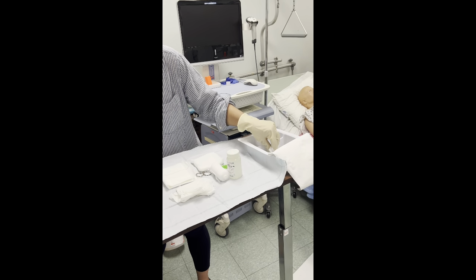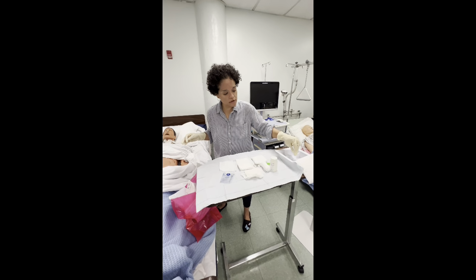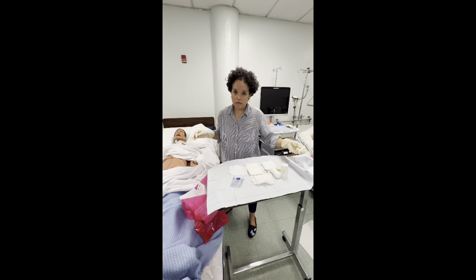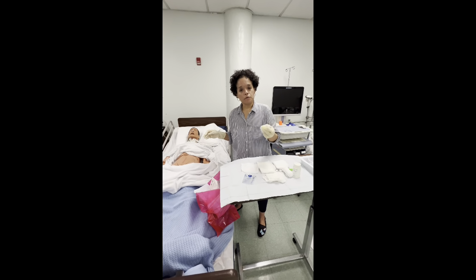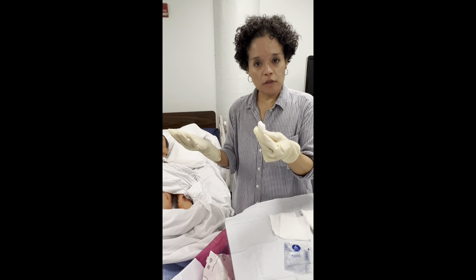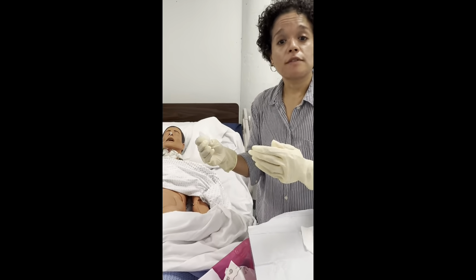So over here, I put the gauze into the container. You don't want to overly saturate the pad. And if it's overly saturated, just push to remove as much excess. Now, you want to make sure that it's not dripping as you are bringing your sterile hand with the gauze over your sterile field, because that will also contaminate the sterile field. So as I am passing my sterile hand with the gauze over to my clean hand, you want to make sure these two hands never touch.